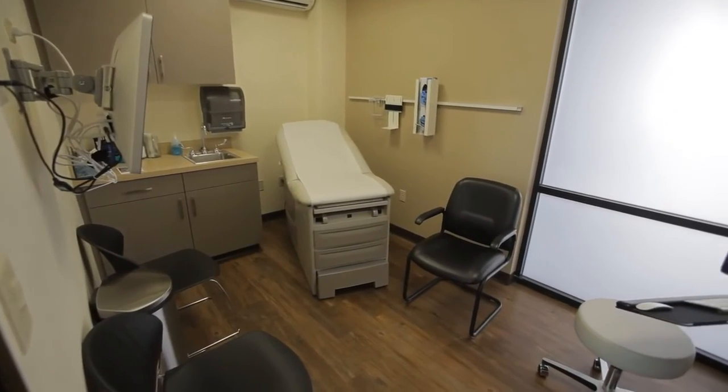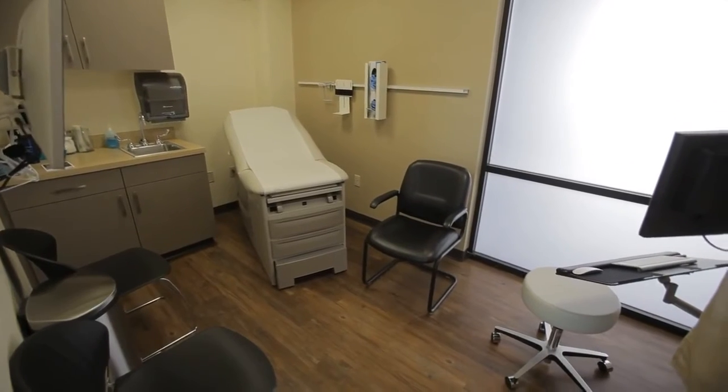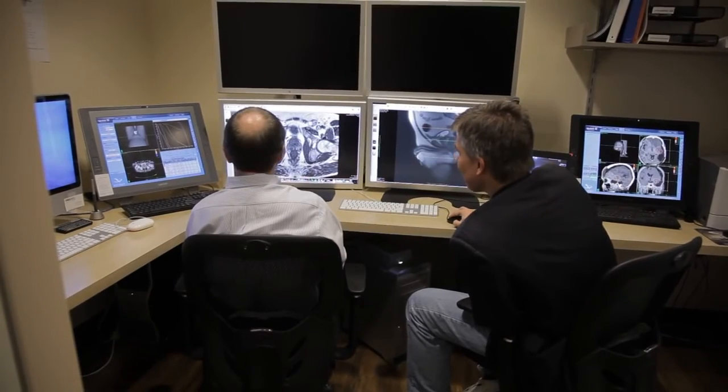I've got my images, my CT, MRI, and so forth fused. I've got this 3-dimensional model of you. And now we've got to figure out, where's that tumor? Where are the things around it? Maybe liver or kidney, right? Organs you don't want to touch with radiation. And I've got to figure out a plan. I've got to do the contouring of this. I've got to create the radiation plan. And I've got to validate that it's actually going to work for the machine. So all of this process of coming up with a radiation plan is called dosimetry. Well, dosimetry is a process that can take a day, it can take a week, right?